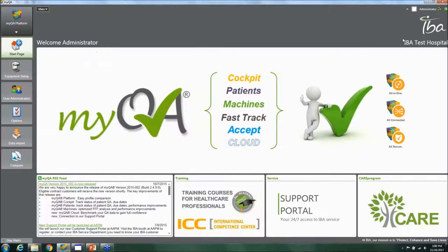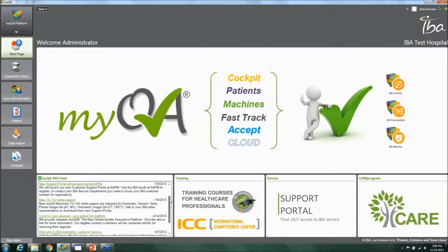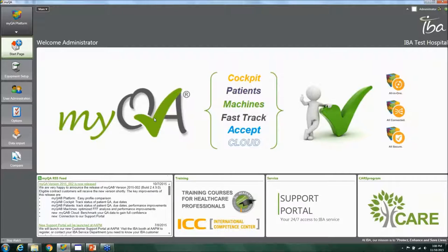When you go into MyQA, you have what's called the welcome page — the start page inside the software. You log in, it shows your name, and you can see a latest news feed telling you what the latest release of MyQA is. You can look at news from shows, training events that might be coming up, keep track of those inside the training tab, and access the support portal as well as the care program.